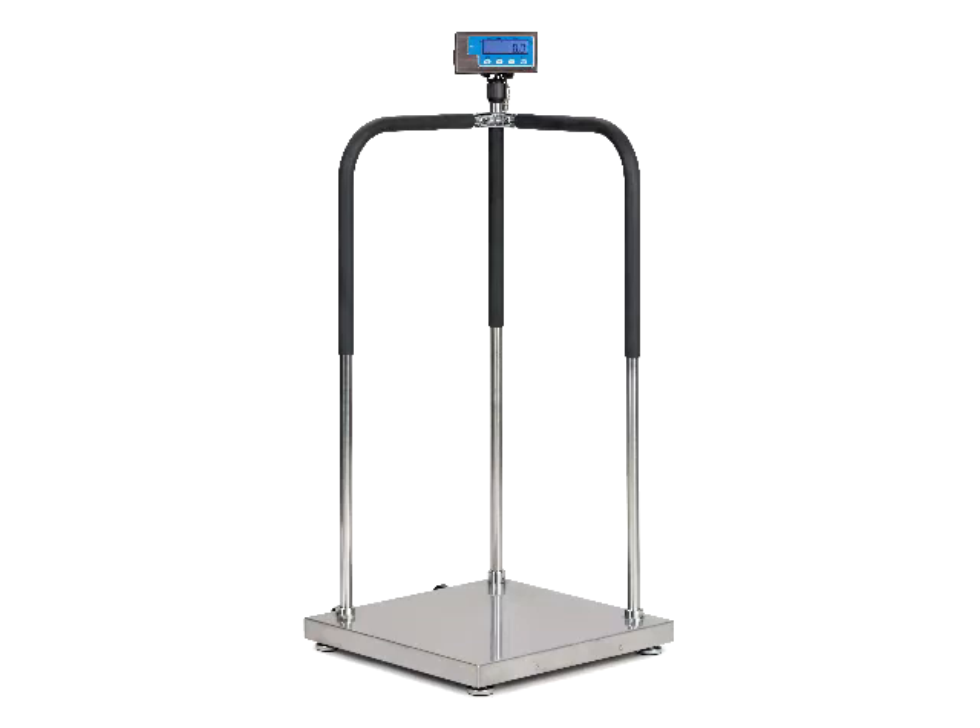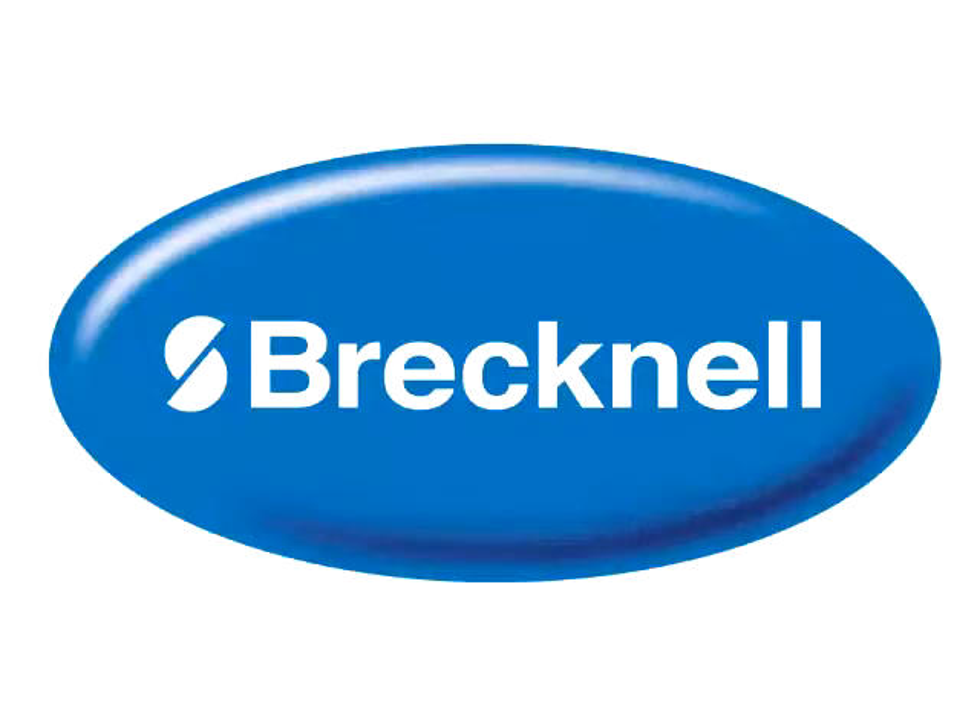Welcome to a how-to assembly video for the MS140 Medical Scale by Brecknell.